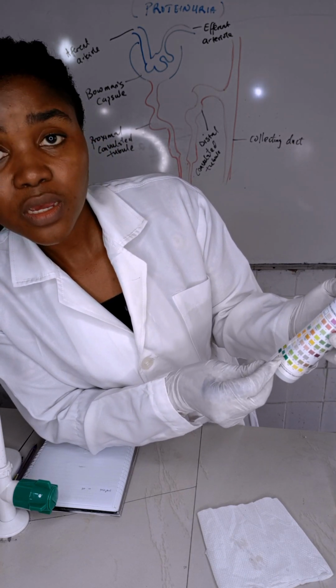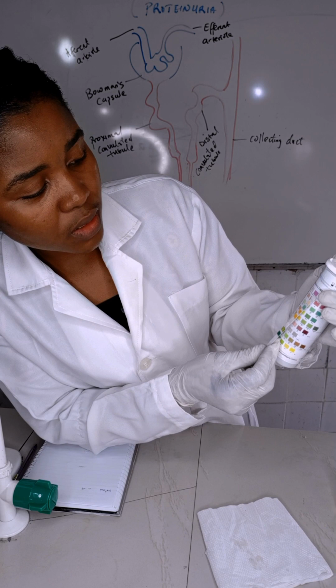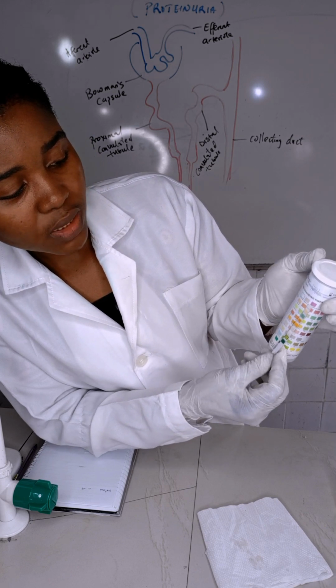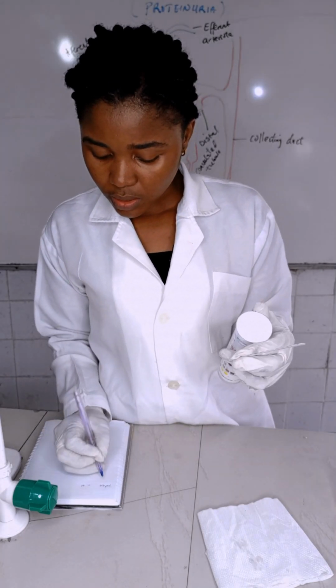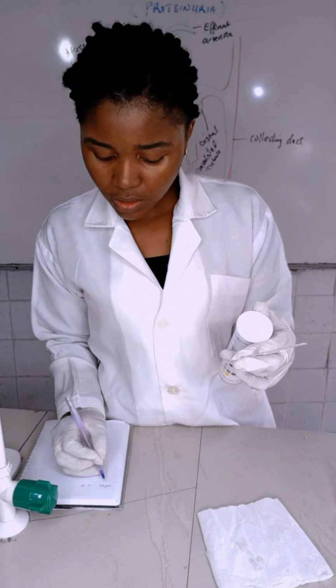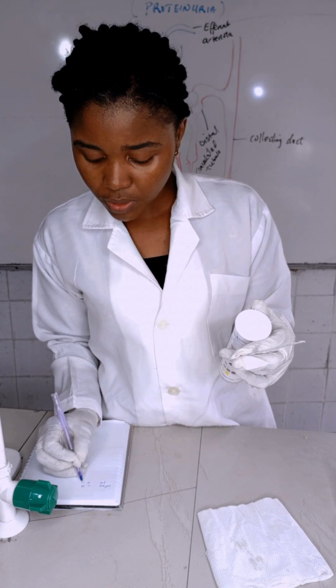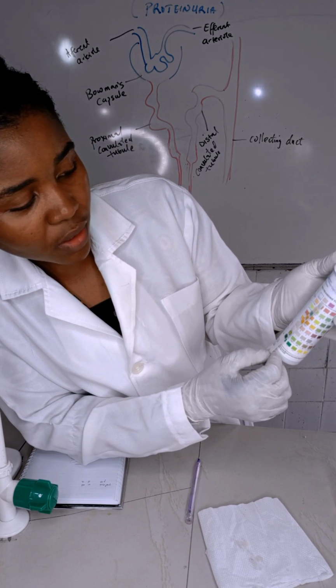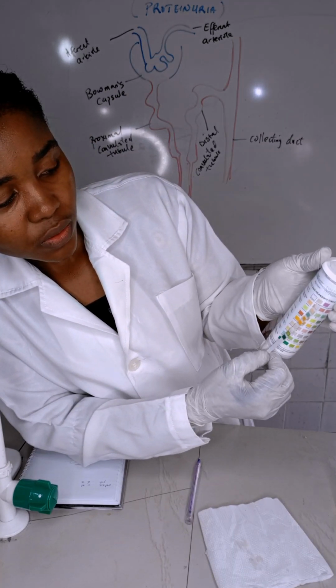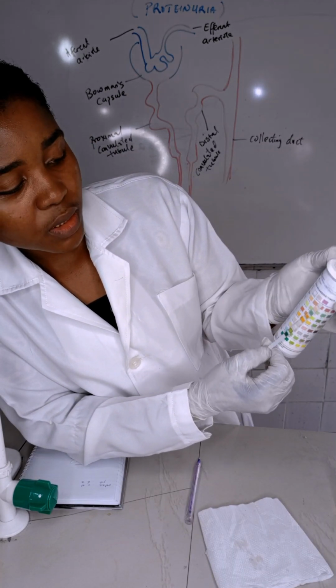pH, there must be a reaction. So you check which one does it correspond with? It corresponds with 6.0, which is the normal pH of urine, which is what? Slightly acidic. So pH is 6.0. Now, the next one is blood. Blood remained yellow, pinkish yellow. So there's no change.